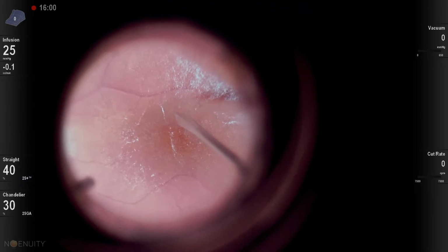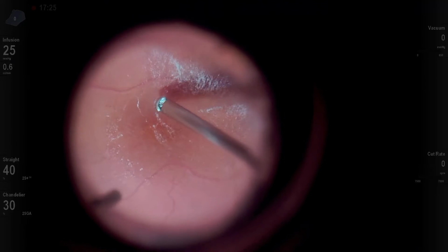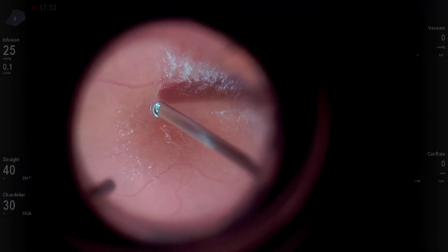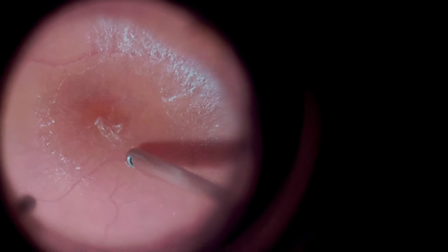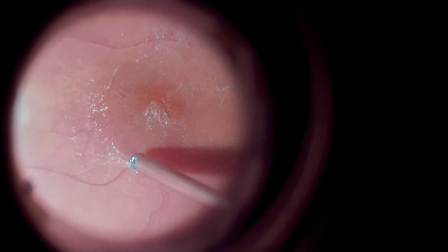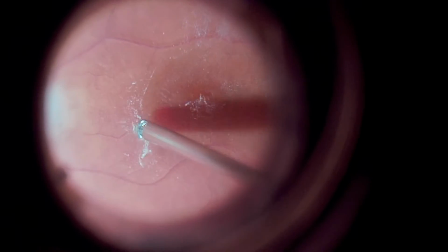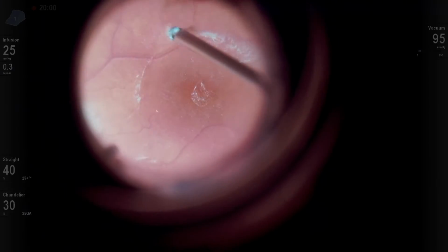Next, he uses the vitrector probe with low vacuum settings and performs circumferential trimming in order to separate the posterior hyalloid from the foveal region and the periphery. Patients with vitreomacular traction syndrome exhibit abnormal vitreoretinal adhesion, and therefore, when performing maneuvers to detach the posterior hyalloid, it is also necessary to be very careful not to cause iatrogenic tears in the peripheral retina.